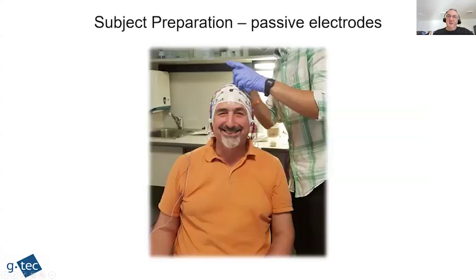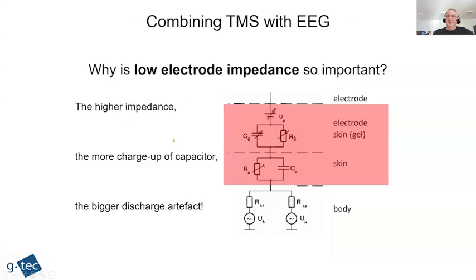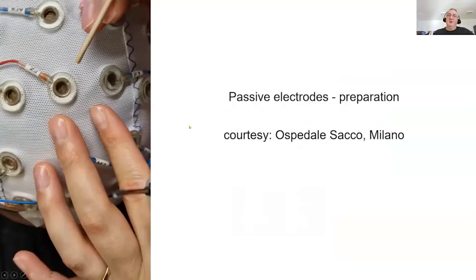This is how the electrodes and the wires should be positioned. So we group them by the left and right hemisphere, and their way. So this is an example with the passive electrodes, and because our skin is always somewhat greasy, we actually have to clean it, and we usually clean it with an abrasive agent. Some examples would be SkinPure from Nihon Kohden or NuPrep.